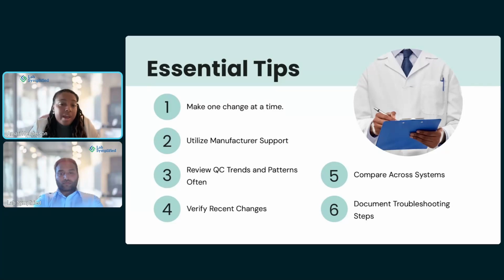Let's compare cross systems. That's why I mentioned maybe if you had a nearby lab that you can run your controls on, just to see if they have the same issue. Are they on the same reagents? Are they on the same calibrators? So that you can help pinpoint that issue by utilizing another lab.